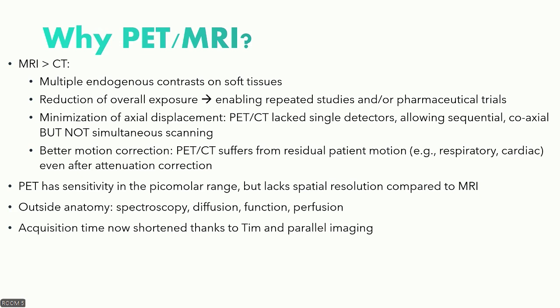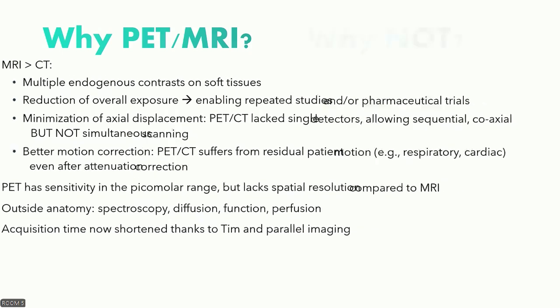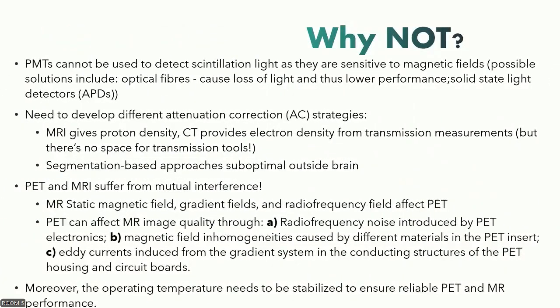And nowadays, one of the caveats might have been the longer acquisition times of MRI compared to CT. Now, if we have long acquisition times, usually we also have a lot of sequences acquired. So it's a trade-off between multimodality, multi-contrast, and acquisition time. But actually, if we just want to acquire an MPRAGE, a T1 weighted, and the FLAIR, other than the PET, this can be done quite easily. Why not? Please stay with me and don't be scared by all these things.